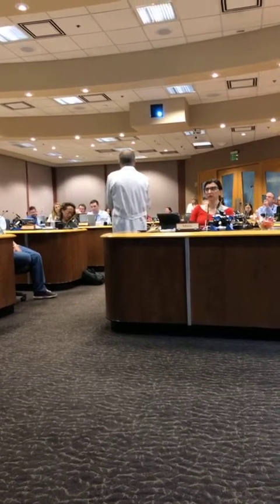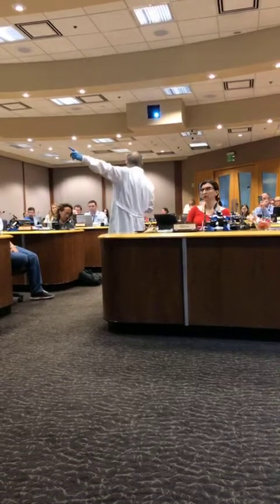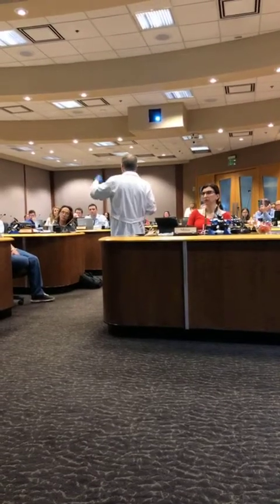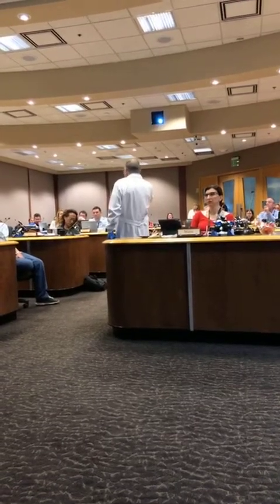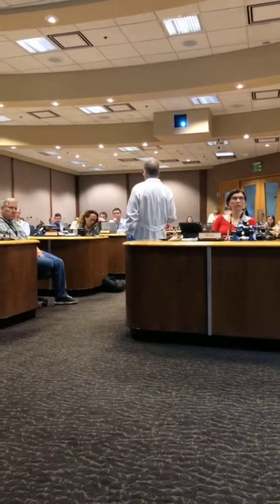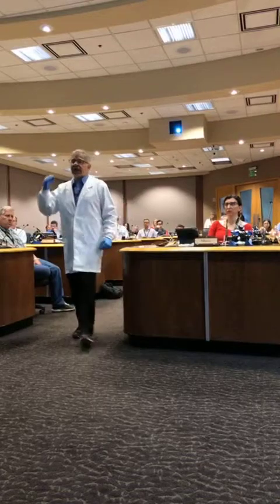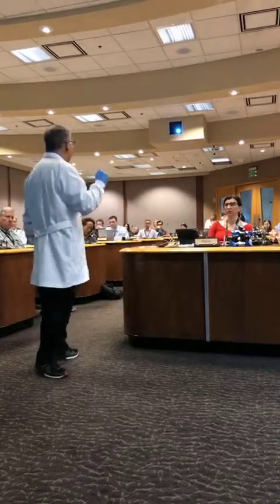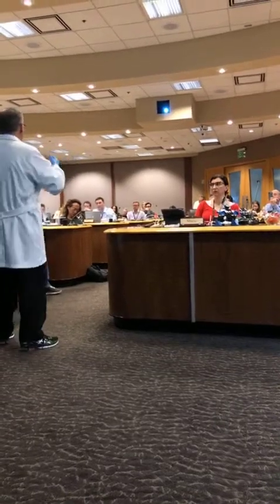When you watch me do it, it will be a little fragmented because I have to wait for the router to go up on the screen and wait for the flash to cycle. But in your practice you can just bang off the photos very quickly — they don't take very long. We had problems in each of the exercises based on the logistics of the room setting.